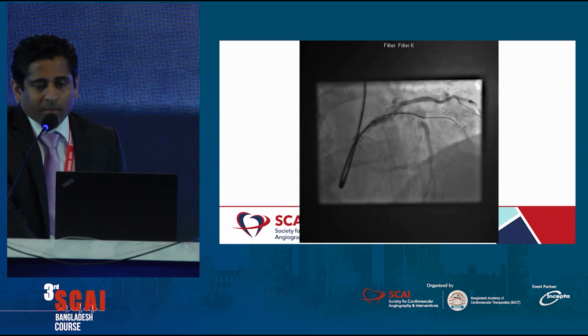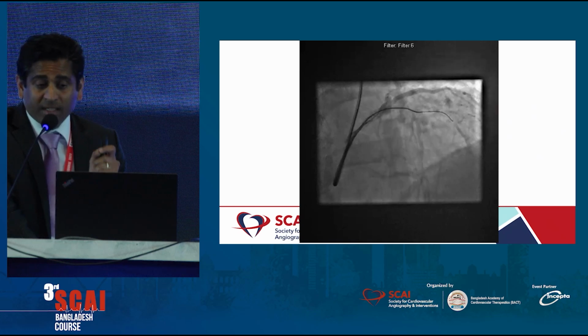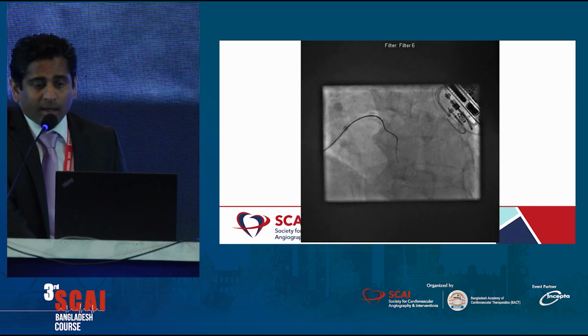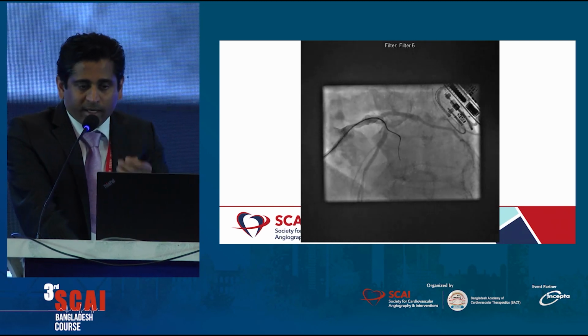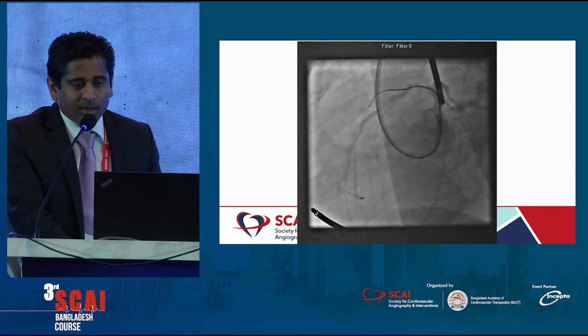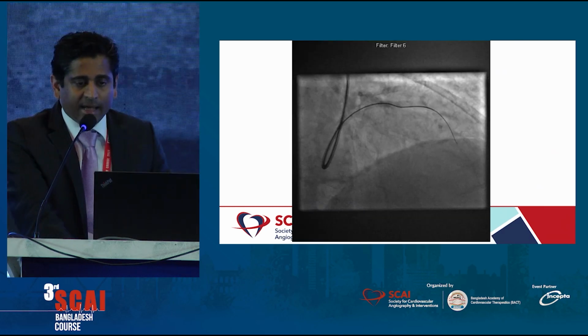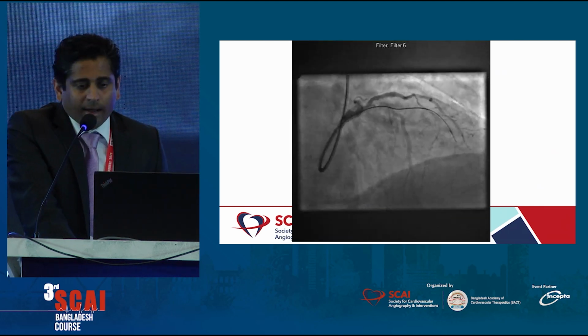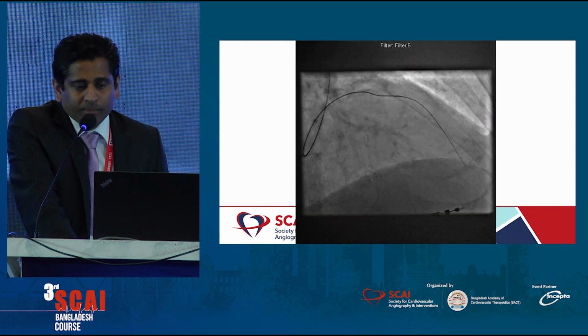And we confirmed in the AP cranial, RAO cranial, it looks good, but we have to check in the other view. So we did a LAO cranial, and you see the wire is going more outside. And when we did the true lateral, you could see we are completely off track. So we had to bring the wire back and then redirect it, which is what we did. And we were relatively in a good position. So we pushed it further.